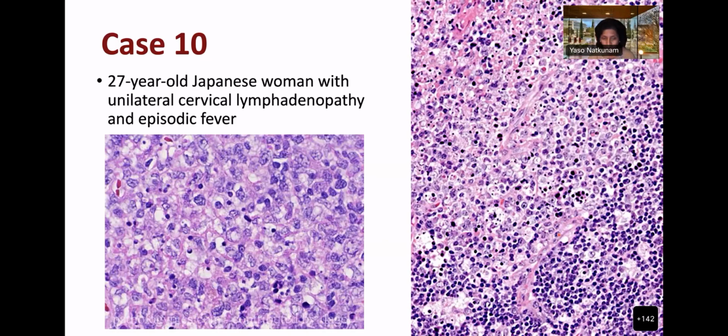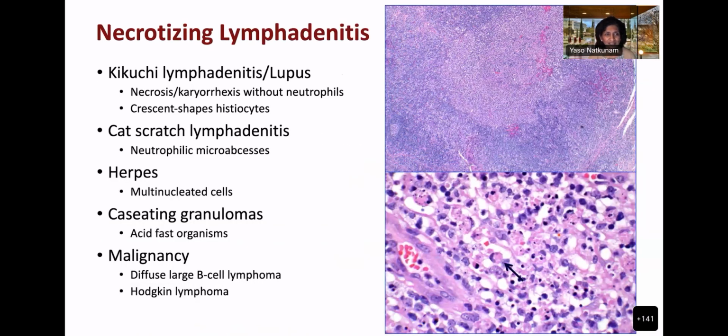So thank you everybody for participating in the differential diagnostic consideration. I want to keep the differential diagnosis as broad as possible. That was what this exercise is about. I think I've given you a lot of things, but you have already answered it. What am I trying to point out here? Necrosis.